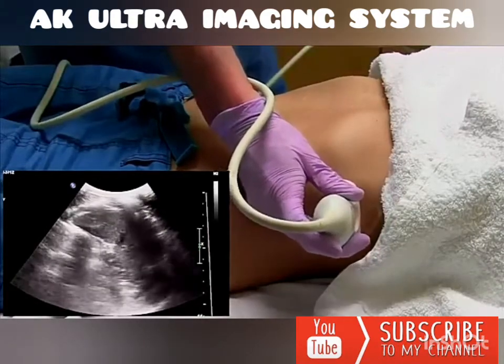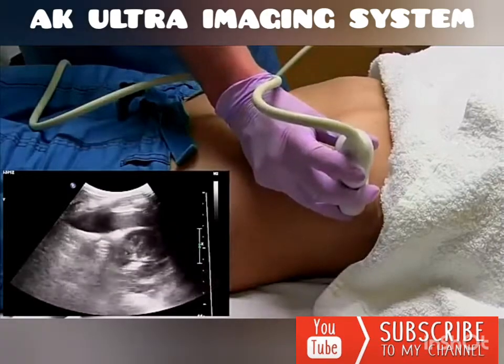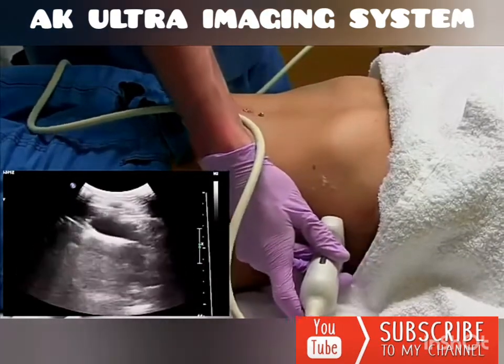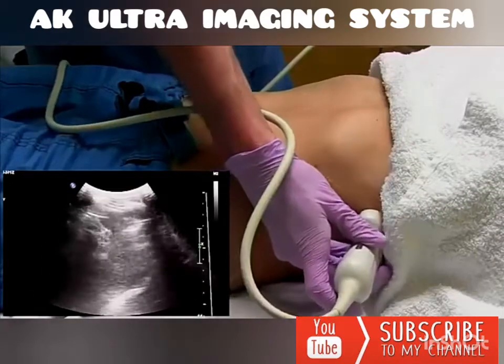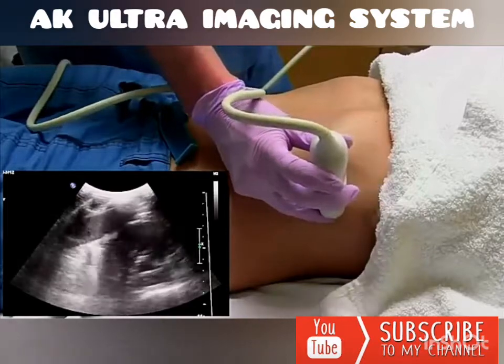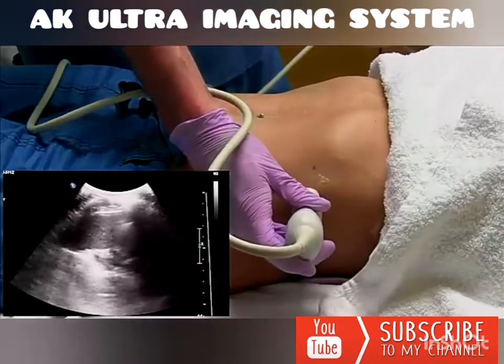But all you could do is just angle, maybe come a little more anterior or posterior to get around those ribs, and just sweep through as much of the spleen from these different windows as possible until you feel like you've seen the entire spleen.